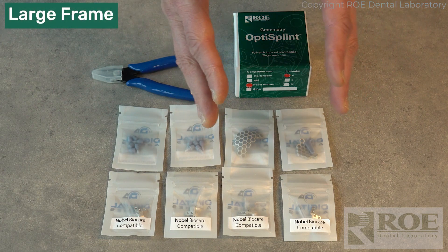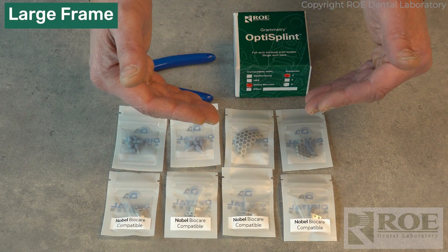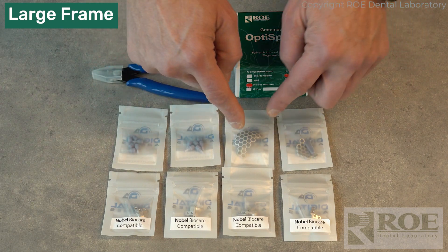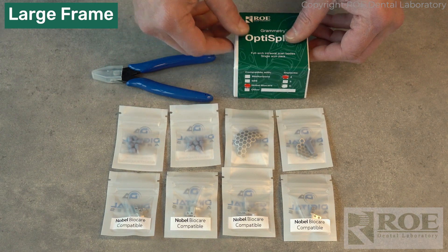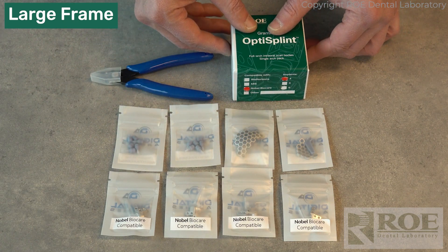If you have a patient that has a wide arch or you're including some posterior implants, then you may want to use the large frame. You could also trim the sides of it with the snips if you need to fit it in.